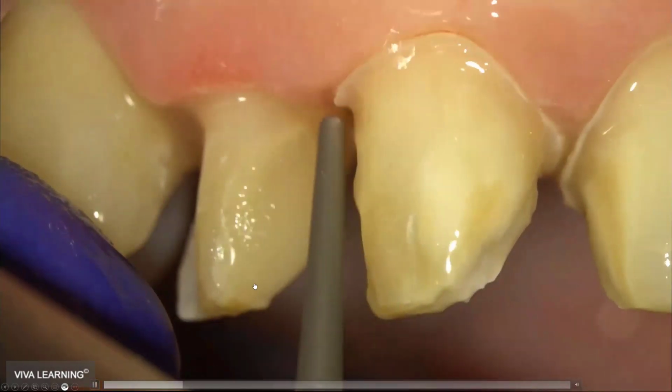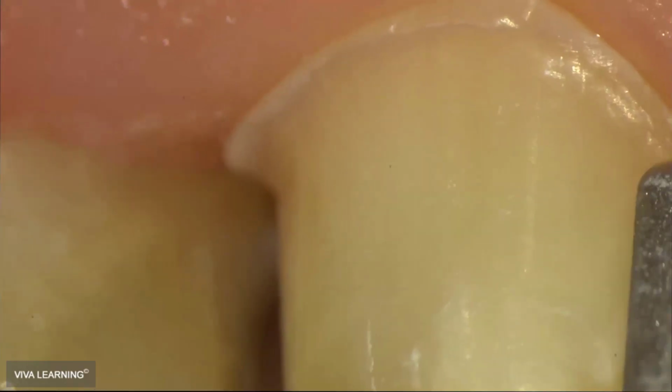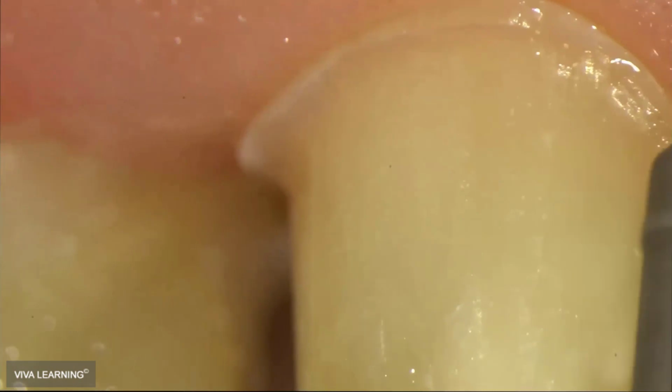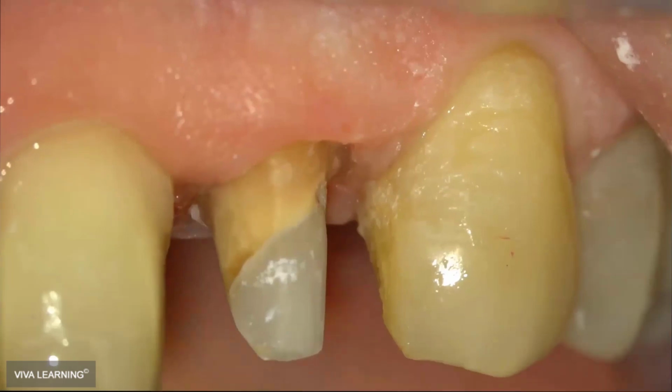But for the laterals, we needed to place the margin more subgingival, because they were teeth that had some root canal treatments, and we wanted to hide the discoloration of the teeth.